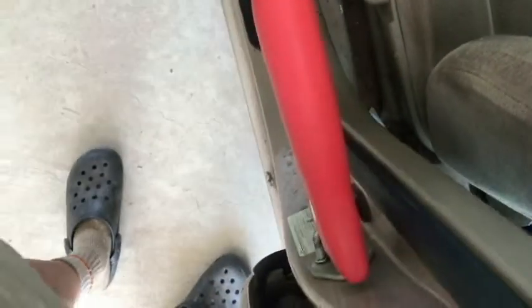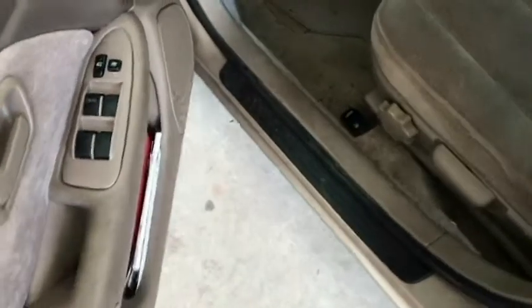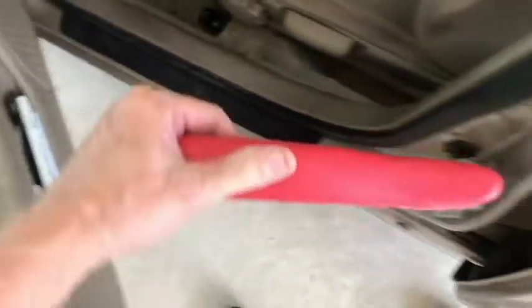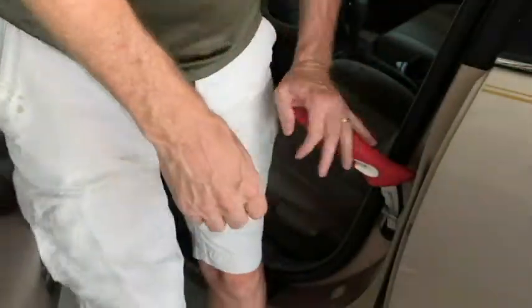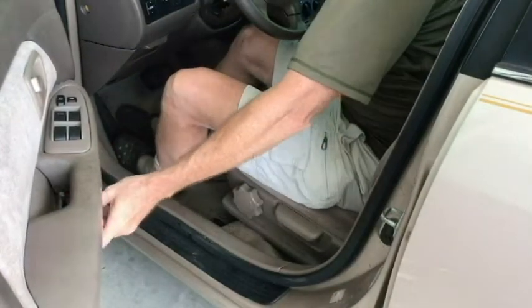So here's the striker. You can see this has notches in it. Just take it, put it right in there like that, and put a lot of weight on that. I think it said 350 pounds was the maximum. So what I'm thinking is I would have it here on the side of the door to begin with. If you have trouble getting in the door, you put it in, and then just put it back. Pretty simple. Now you can also put it in the glove compartment or your console, wherever is easiest to use.